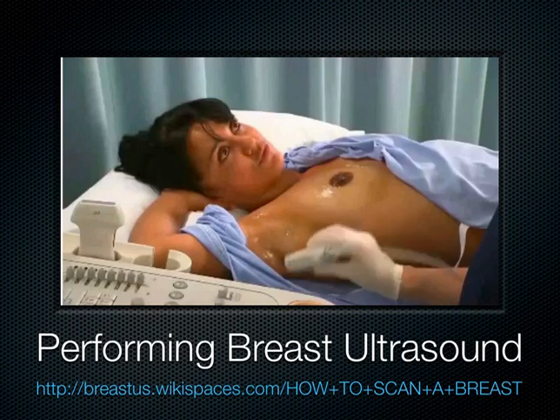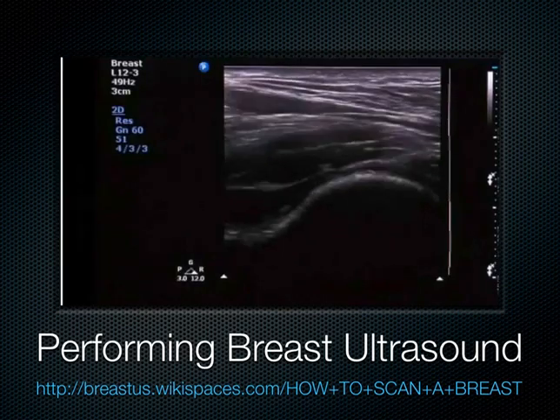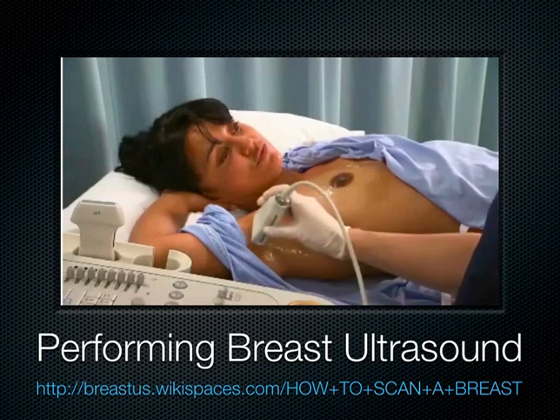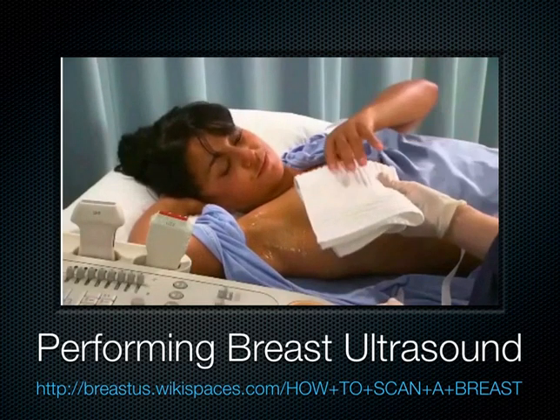Return the transducer to the midline in the longitudinal plane. Optimize the image, then freeze, annotate, and save the image. Repeat the process in the transverse. Give the patient a towel or cloth to wipe off the gel.